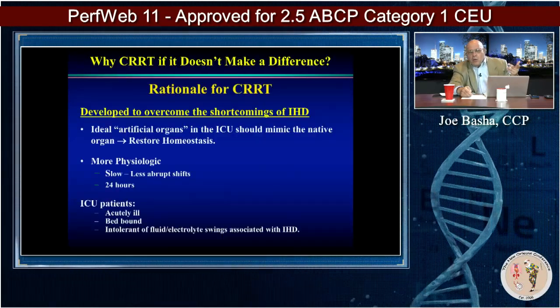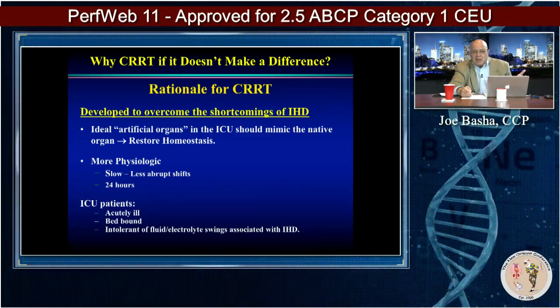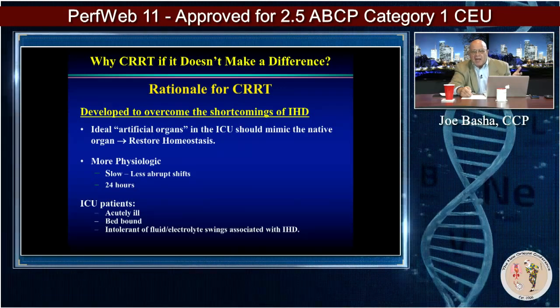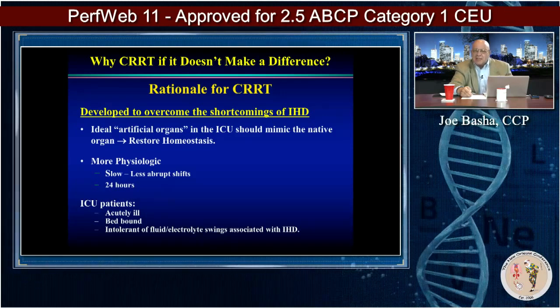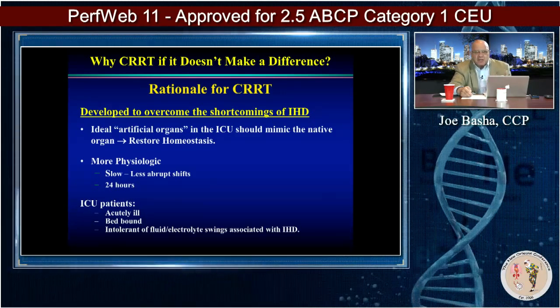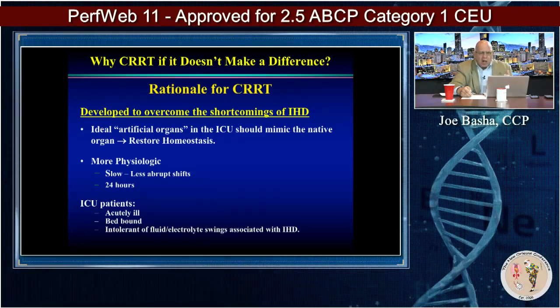So what is the rationale? Why do we do this? Well, CRRT became popular to try and overcome the shortcomings that exist with IHD that I talked about earlier. Fluid shifts, when they're done over a very short period of time, are very, very hard to do, and they're hard on the patient.